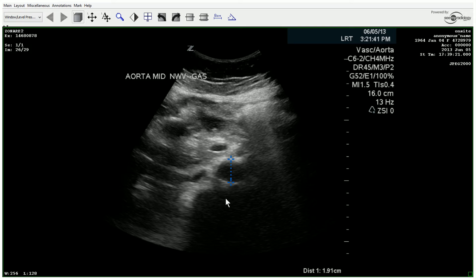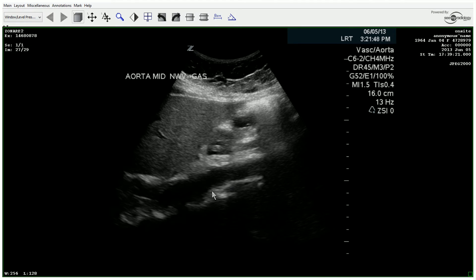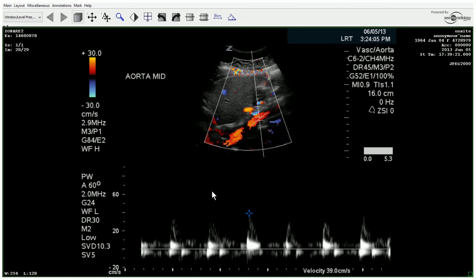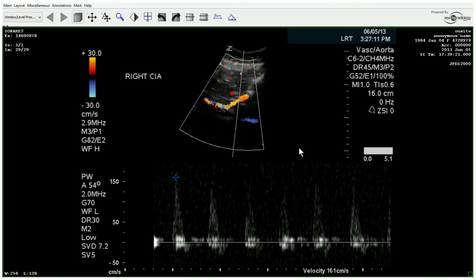The sonographer was able to obtain an image of the mid-aorta, showing there's no aneurysm at that level, and the flow through the aorta looks fairly normal. We also take a look at the right common iliac artery and show that it has a pretty normal waveform — sharp upstroke, rapid downstroke, and reversal of flow.